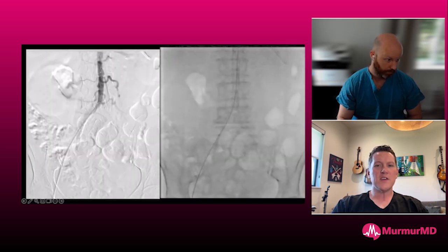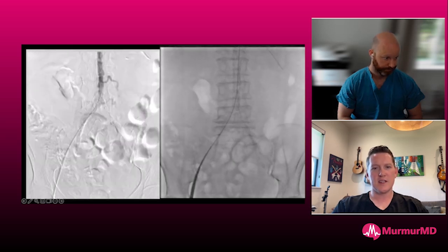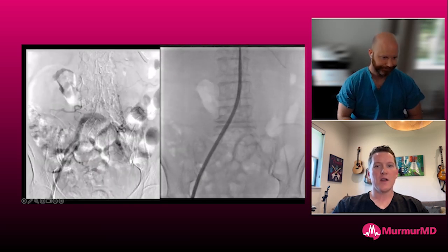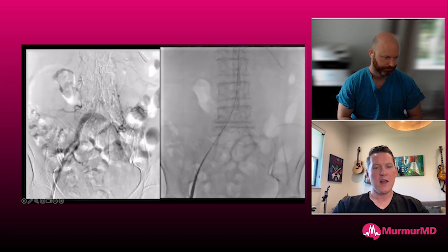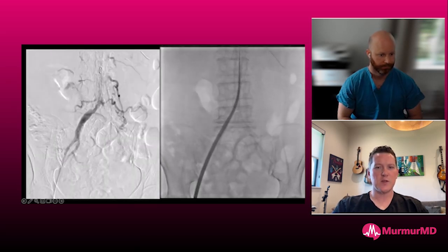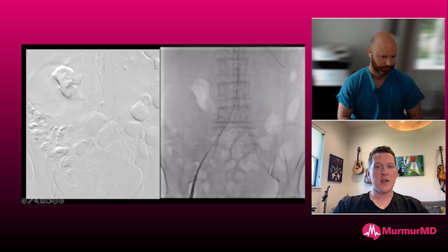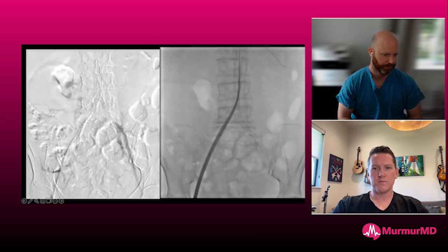Hey, Chris, I think the other benefit of this approach, as opposed to an axillary approach, especially in a sick patient like this, is you've revascularized the iliacs now. If you have to bail out to ECMO, if something goes really wrong, now you're actually going to have access to do that. It's not perfect access, but I think that's a real benefit. If you have the choice between revascularizing iliacs, especially relatively straightforward ones like this, and going axillary, my choice is always femoral, because if I have to put an ECMO cannula in there, it shouldn't be a big deal. So I think that's an important point. Yeah, I think that's a really, really good point.